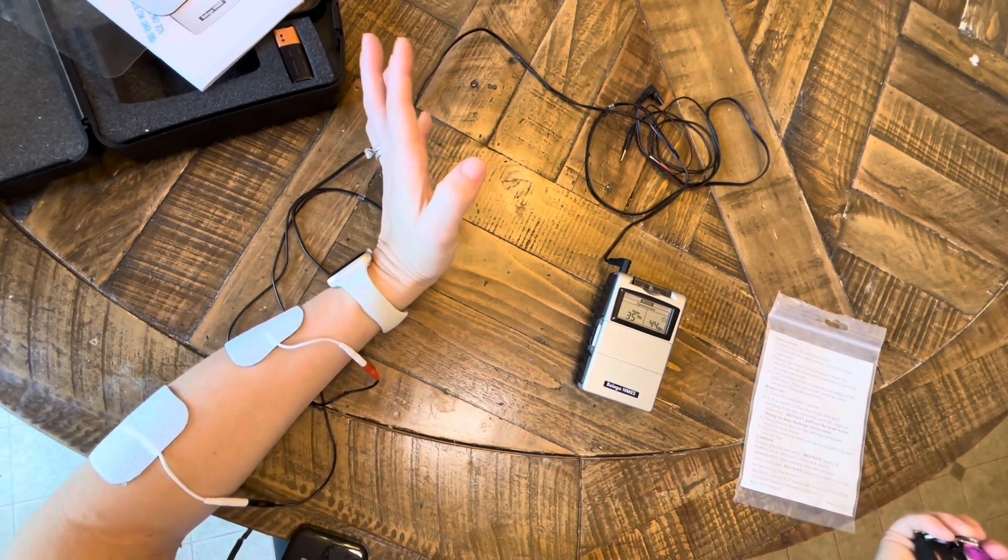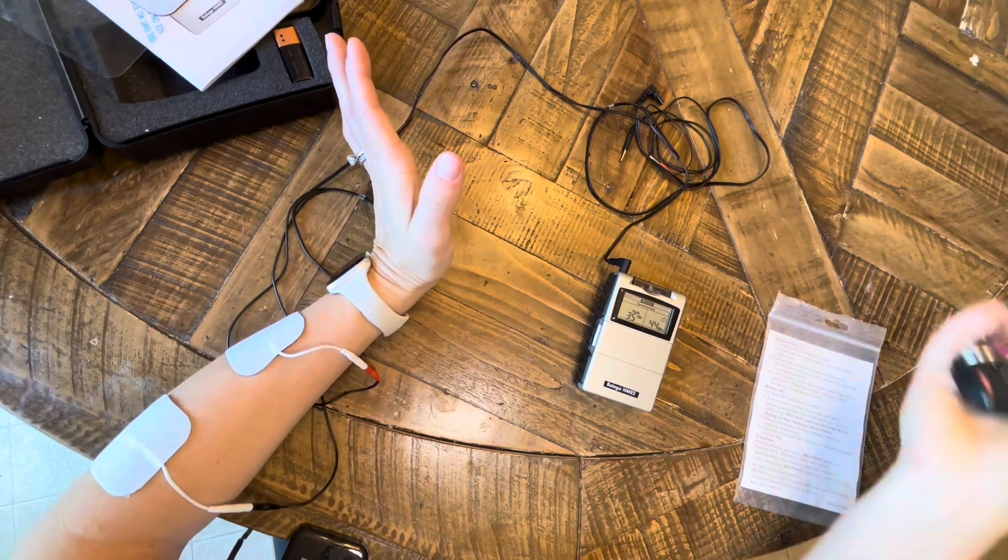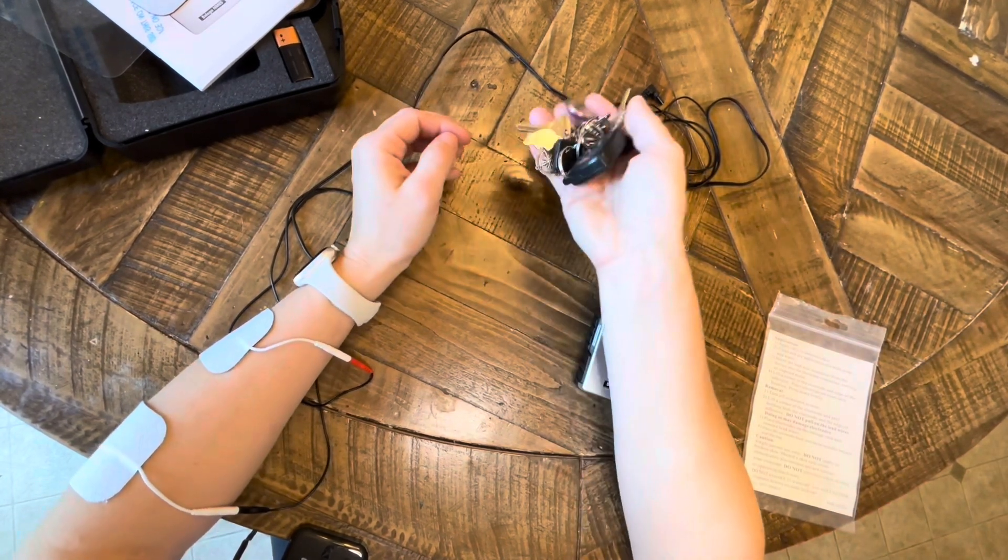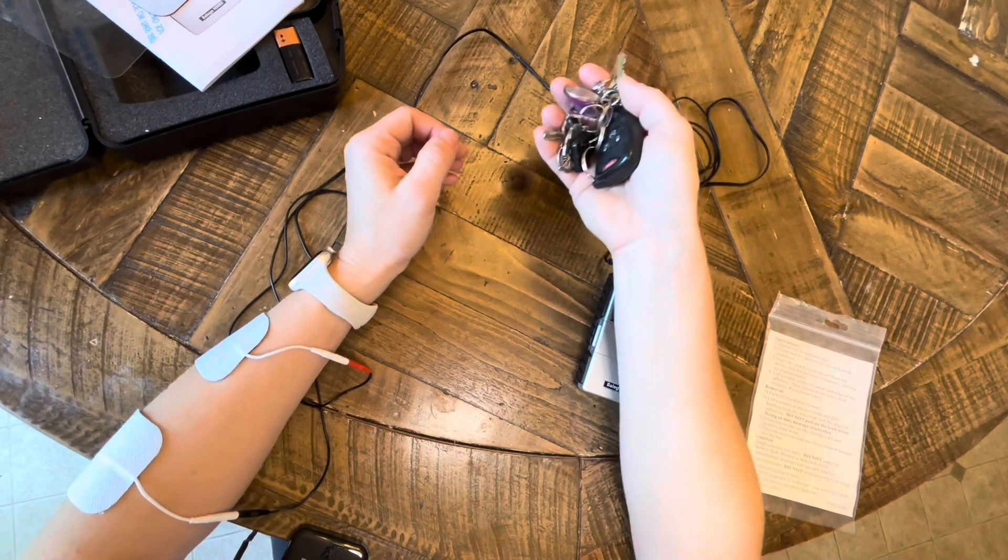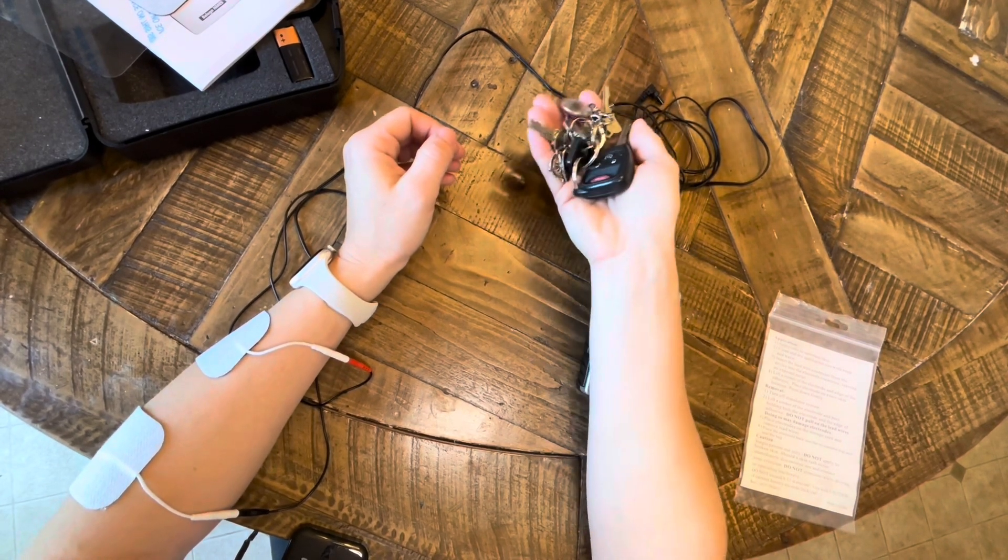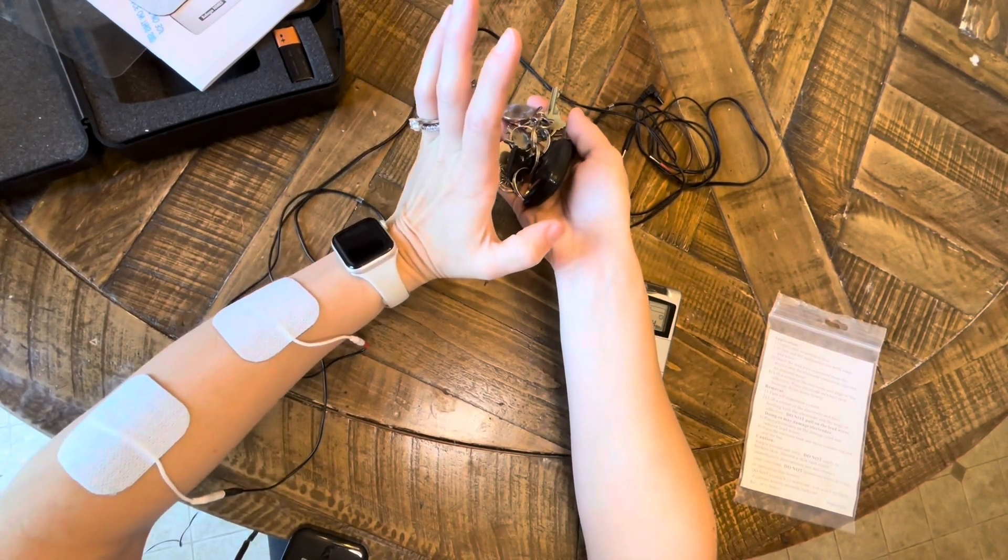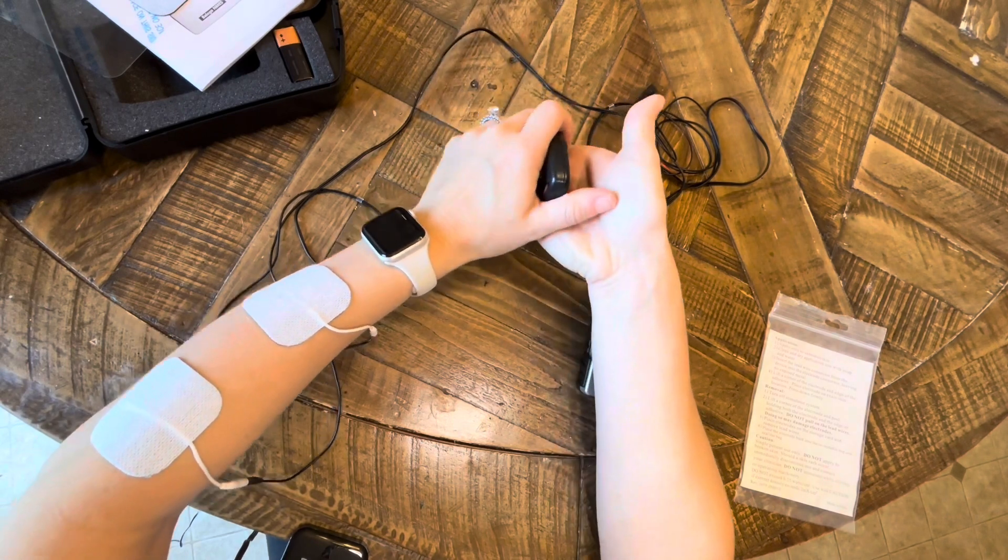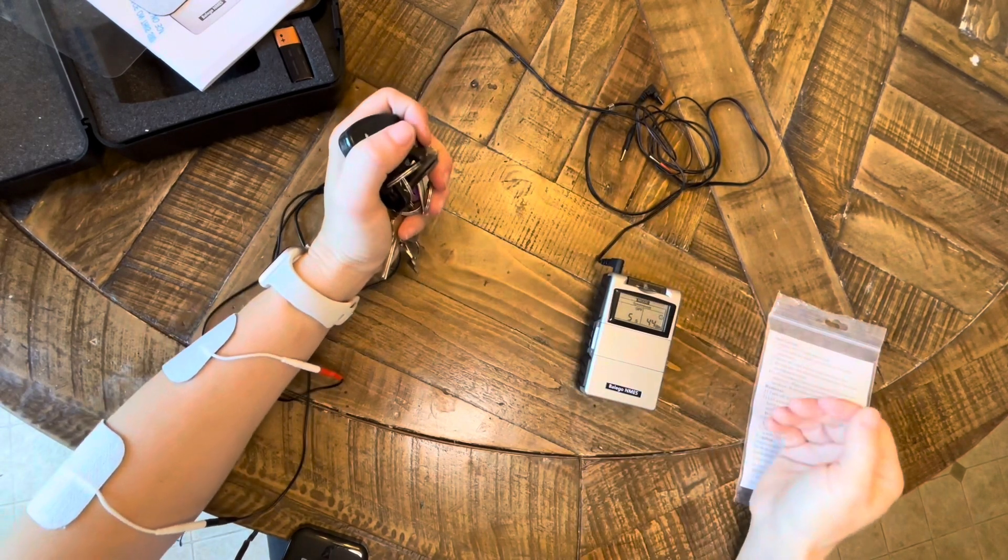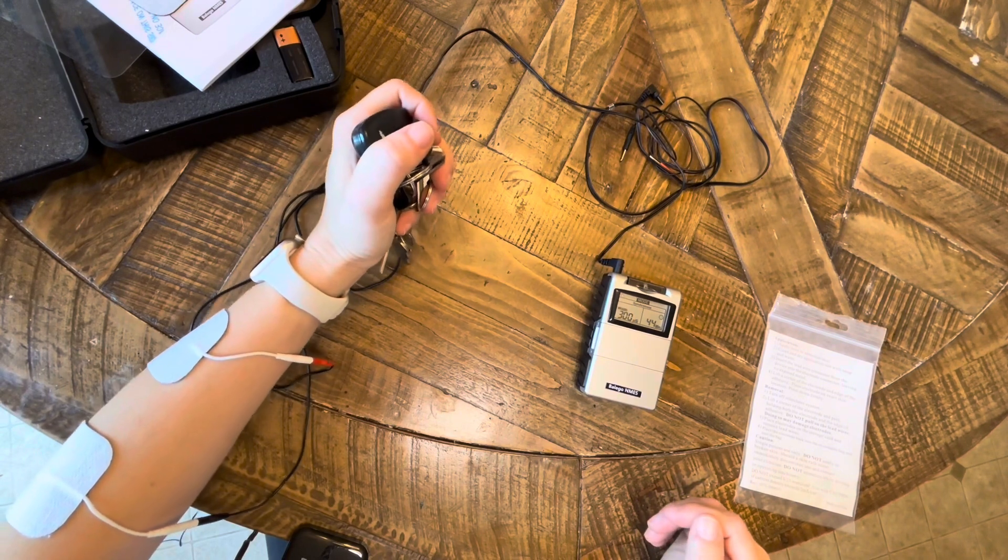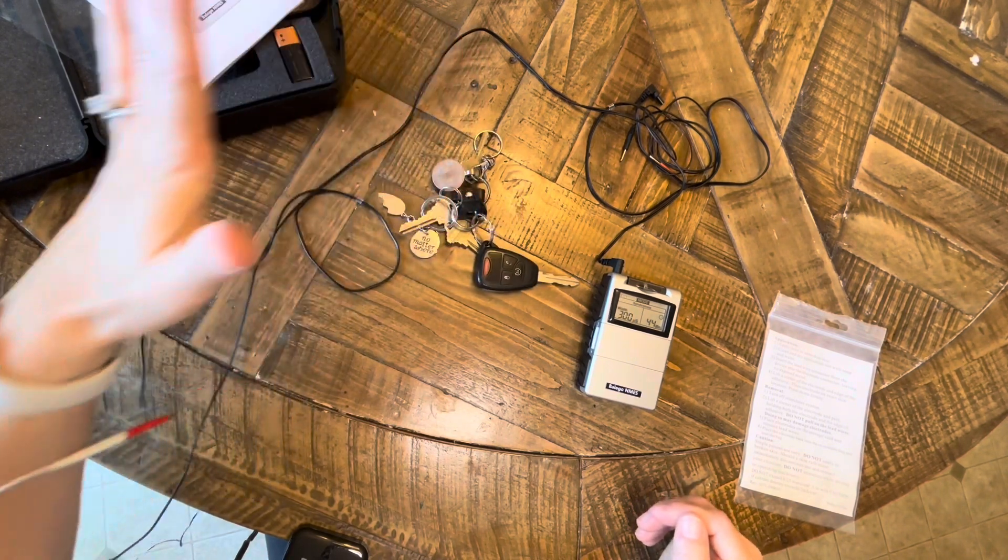We're only stimulating those extrinsic extensors, so you'll get wrist extension and MP extension but not necessarily at the PIP and DIP. So you want the amplitude high enough that you can get your hand open as much as you can to grab the item that you want.